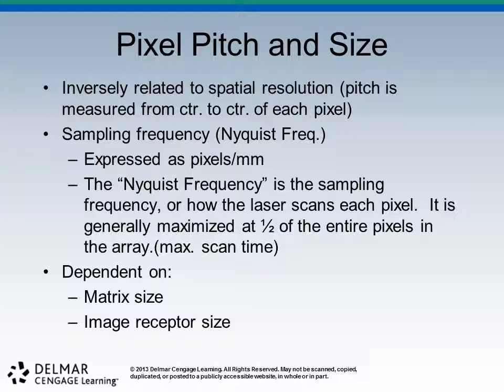The other pixels that we aren't scanning, as I said yesterday, are averaged in. So we'll sample about half, and that's again at the max. We usually don't. But let's say we did, and then the ones that we're not sampling, we average those in to the left and to the right.